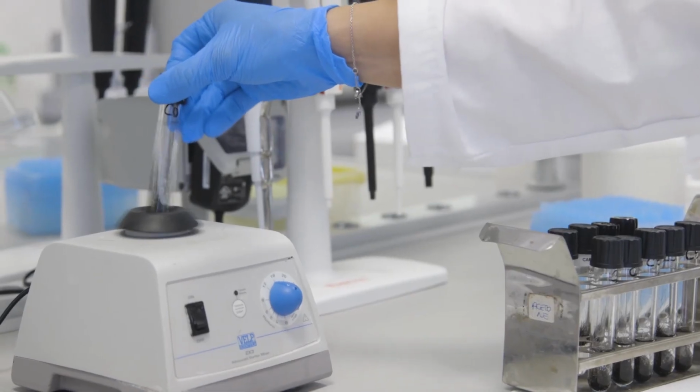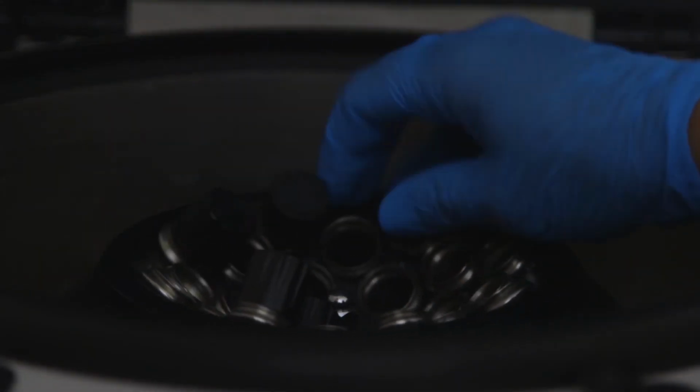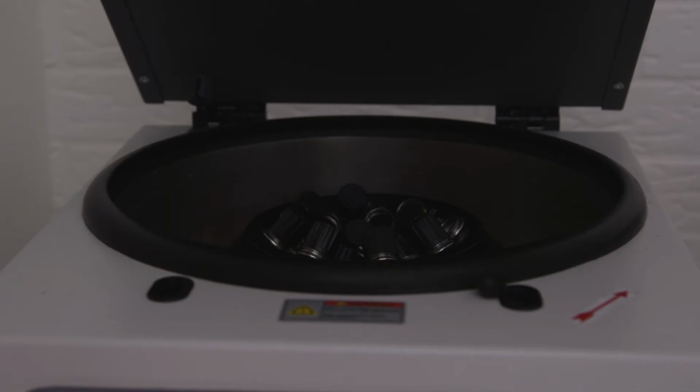If the pH is not correct, you can make corrections with sodium hydroxide 0.1 molar and hydrochloric acid 0.1 molar by mixing and rechecking the pH after each addition. You can now close the tubes, vortex for 1 minute and centrifuge at 3500 rpm for 5 minutes.